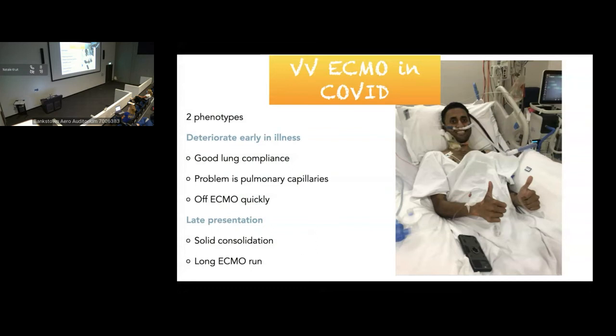The international mortality rates range from around 36 to 54%, which is basically similar to survival for COVID and non-COVID respiratory failure when you're using ECMO, so very similar to the ARDS data. If we move on to the national data, the SARI report takes into account the Delta variant in Australia.